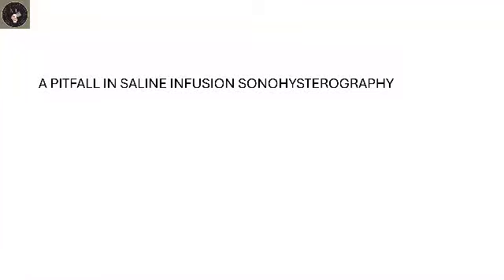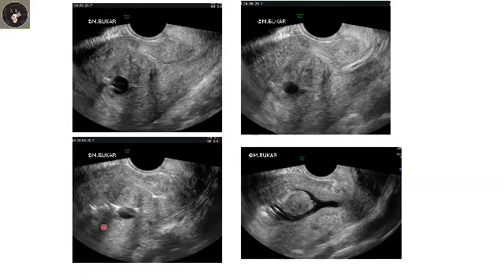In this short video, I would like to address a pitfall in saline infusion sonography. These images were those of a 35-year-old who presented with heavy menstrual bleeding. These are the transvaginal images.